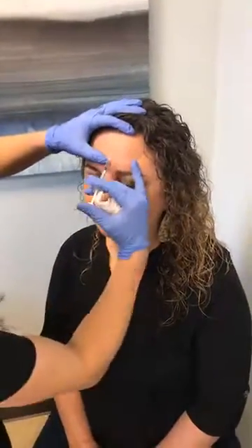All right, raise your eyebrows up. So I'm going to work on these lines through here. Okay, relax.